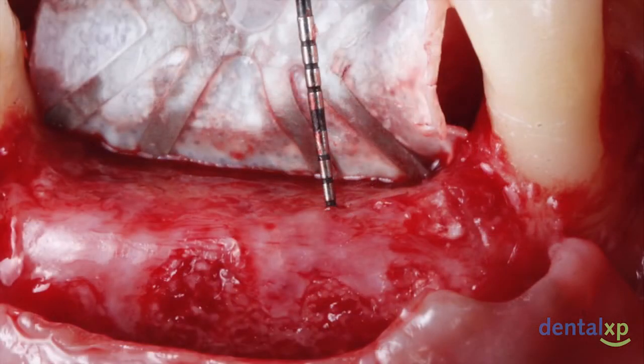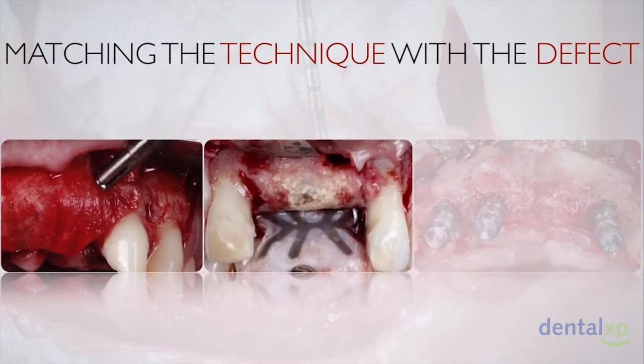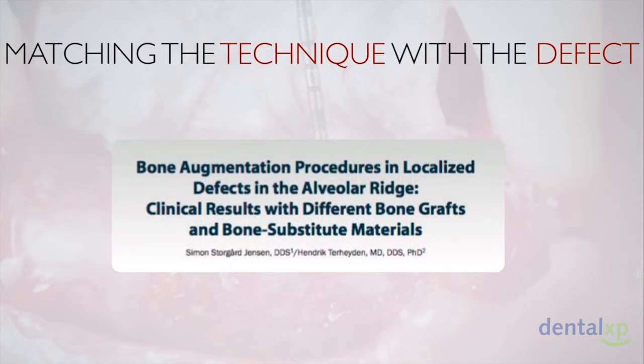So what technique works best? Currently we have a wide array of materials to choose from. We have a variety of membranes, whether resorbable or non-resorbable, different types and forms of bone substitutes, as well as recombinant growth factors to aid in these augmentations. So what does the evidence say?